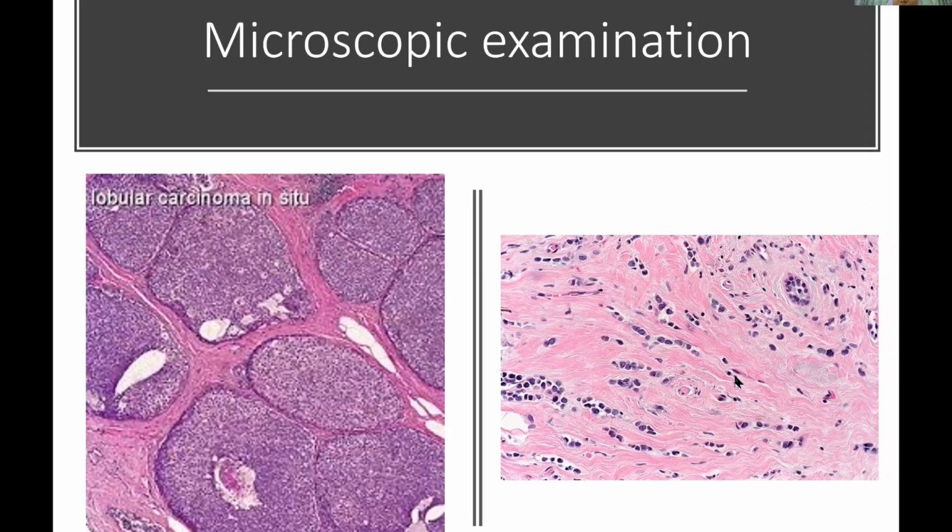Whereas in these pictures, we can see these tumors are already invading into the adjacent structures, because they make an arrangement of the cells in a single line here. Single line, or another name we call Indian file, but there is no tubule formation here, because this is an invasive lobular carcinoma. Normally the cells will arrange in one layer only like this. And the individual tumor cells have evidence of aneuploidy because they're malignant.